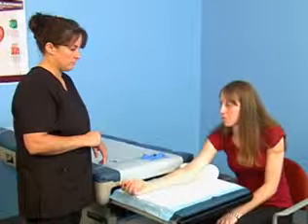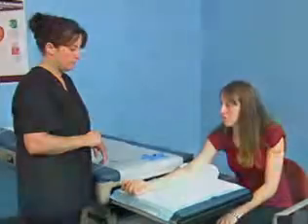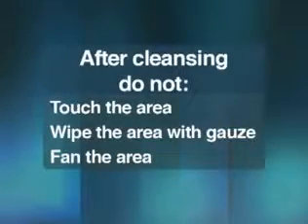Drying also prevents wet alcohol from entering the blood specimen. This results in hemolysis of the blood specimen, leading to inaccurate test results. Do not touch the area, wipe the area with gauze, or fan the area with your hand. This causes contamination of the puncture site, and the cleansing process must be repeated.